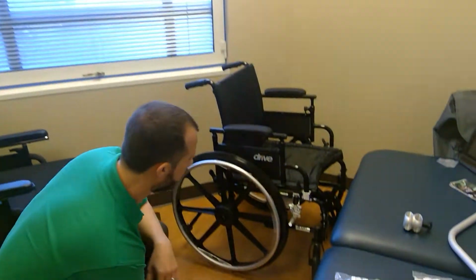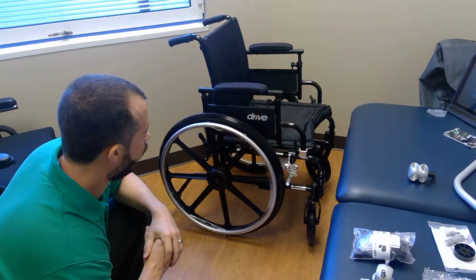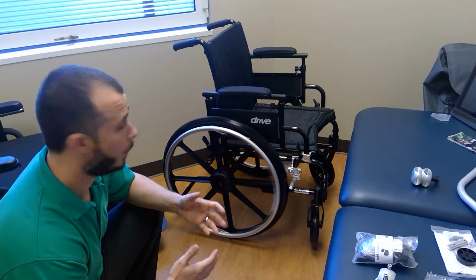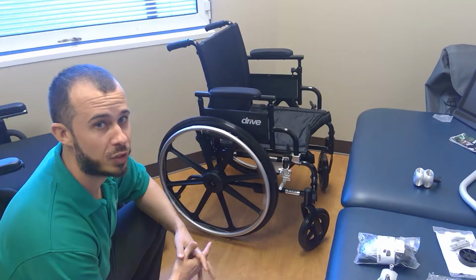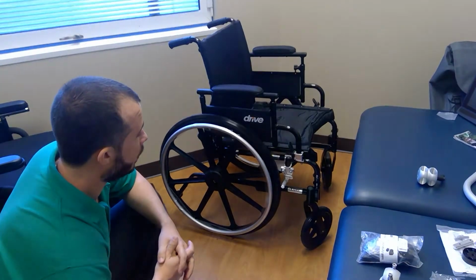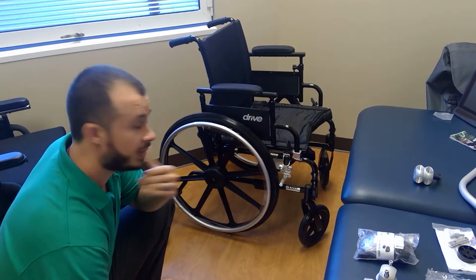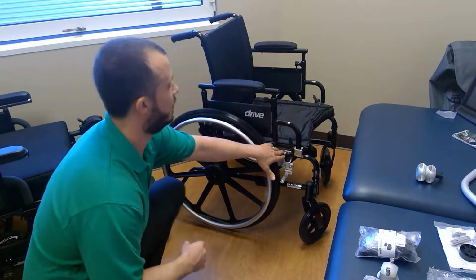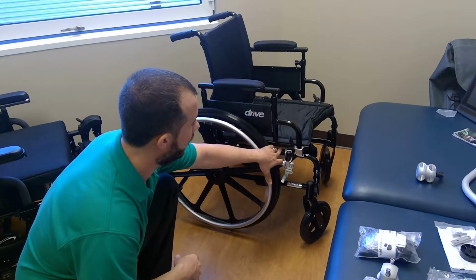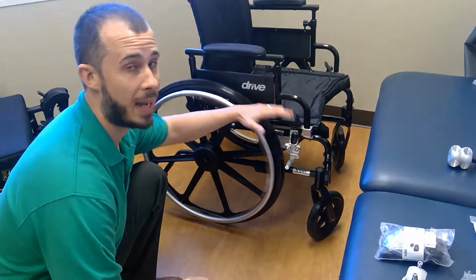And the first thing we want to discuss is where we think this device is going to be mounted. We know that on an I-series device, it has to be roughly 20 to 22 inches away from the client's face. So we want to look at this chair and see, does it tilt is the first question. Because if it tilts, we want to make sure that we're trying to mount to a portion of the chair that will tilt the device with the user as they lean back in the chair.